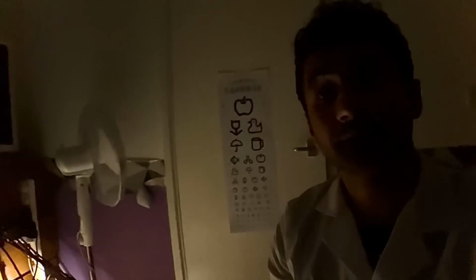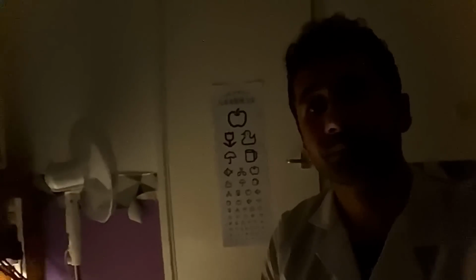Two steps away from giving you back your clarity, and then we'll know what to pop in your spectacles. Here is the minus 12 lens, the minus 12. Straight ahead, sharper with, without, with. And what's the lowest row you can see down to there? Okay, not quite the bottom, but not far off.